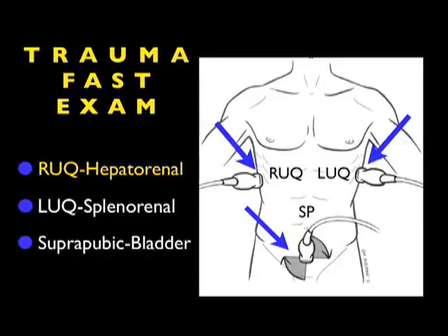So in conclusion, I'm glad I could share with you part 1 of the right upper quadrant view of the trauma FAST exam. Now we know how to recognize a normal examination, looking all the way from the area below the diaphragm through Morrison's pouch and terminating at a view of the caudal tip of the liver. So I hope to see you back as Soundbites continues and we look at part 2 of the right upper quadrant view, focusing on positive examinations.